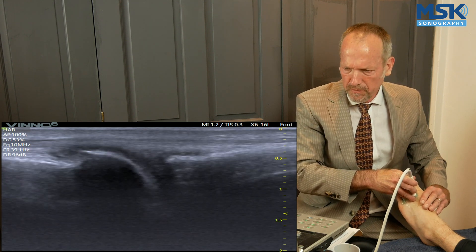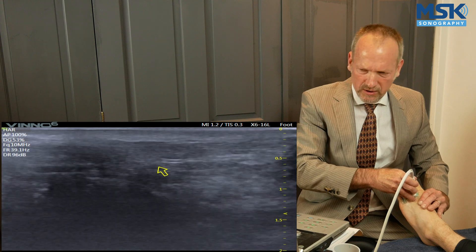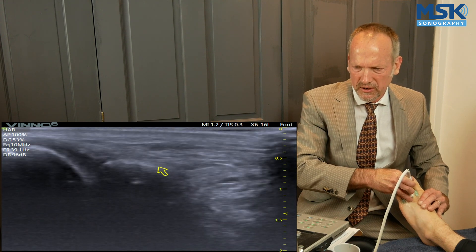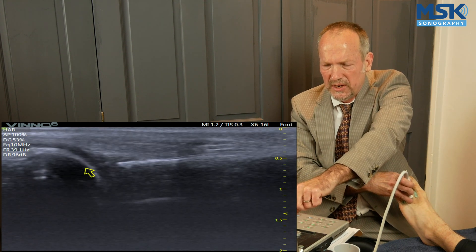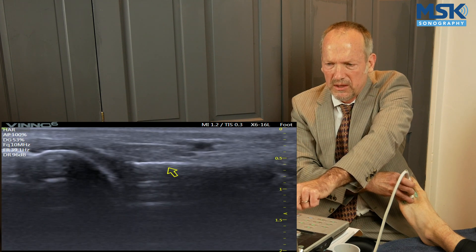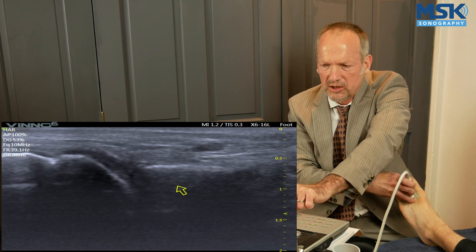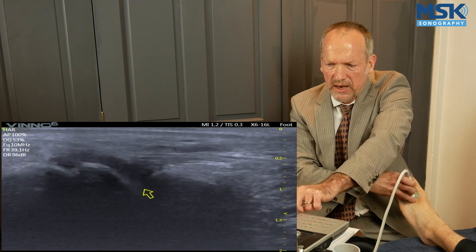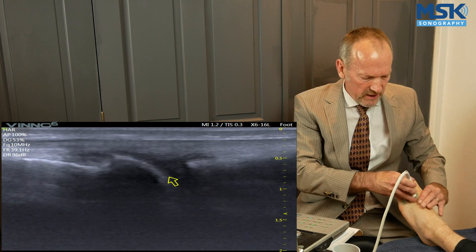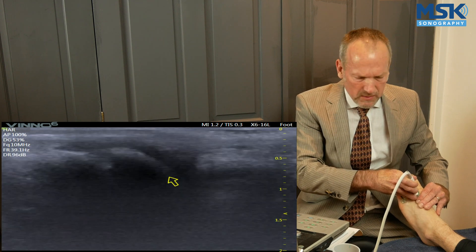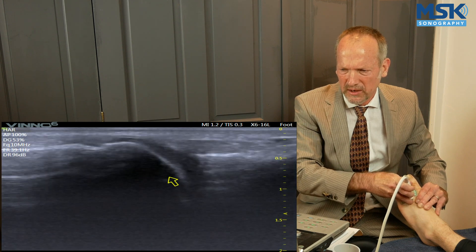As we were describing before, with the joint being in this area here, if we go straight across with the transducer, we find that the third metatarsophalangeal joint is actually over here on the screen. So we need to find the line of the metatarsals so that we find it in the same area. Otherwise the region of interest is too large and nonspecific. The aim initially isn't to view what's in between — it's just to come out at the same point with the next joint, and you can see that we're a little bit better there.